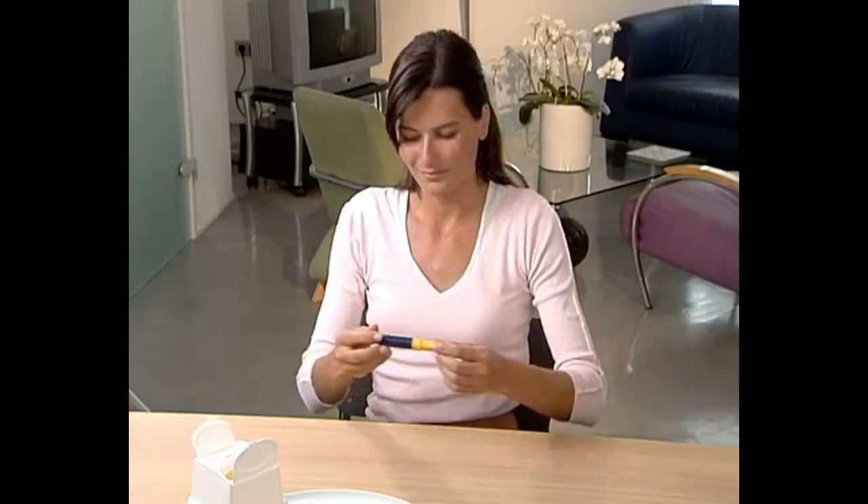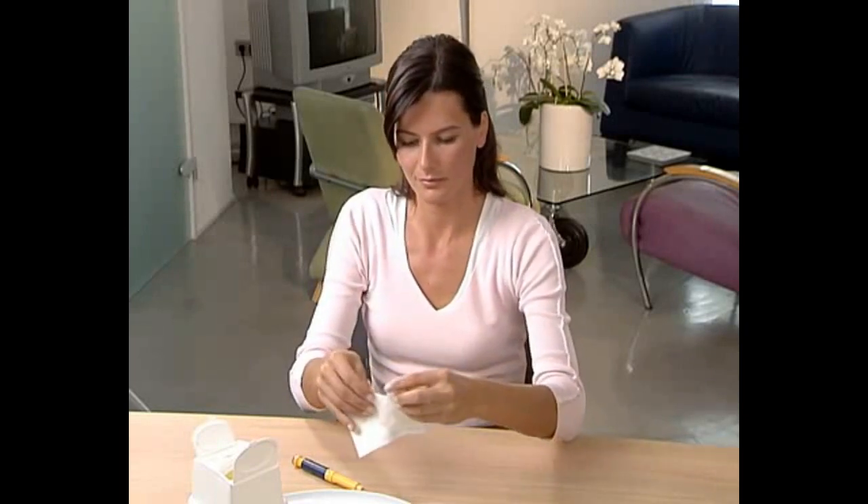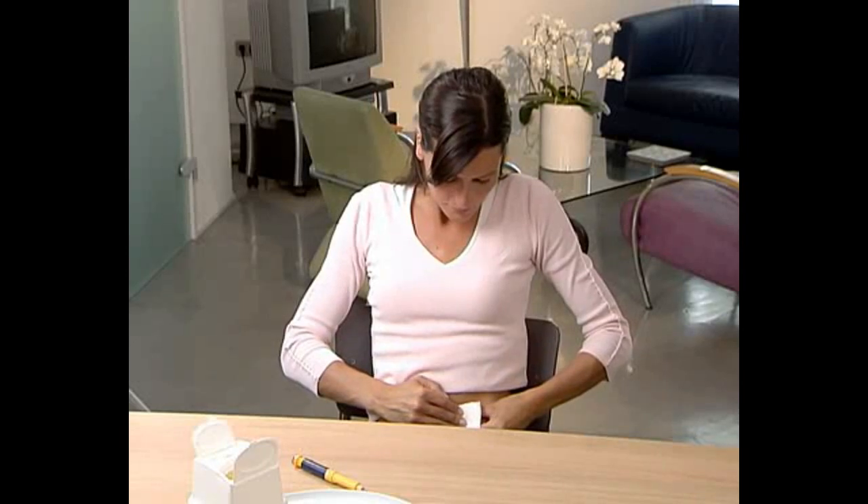Check that the injection button on the pen reads zero. Gently cover the injection site with a piece of gauze moistened with disinfectant. You have now successfully injected your dose of Puragon.